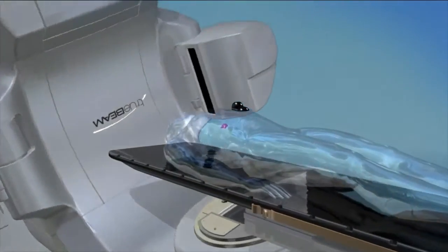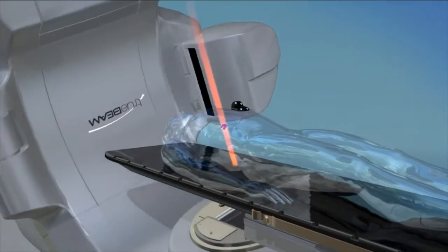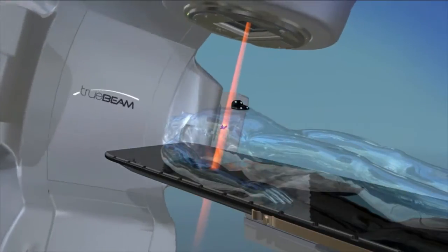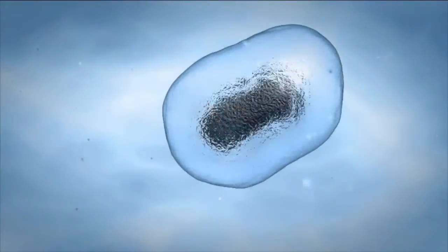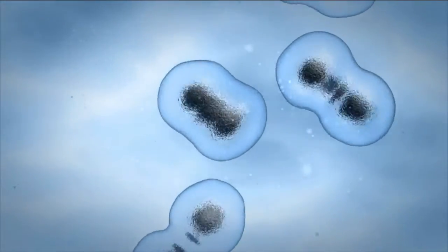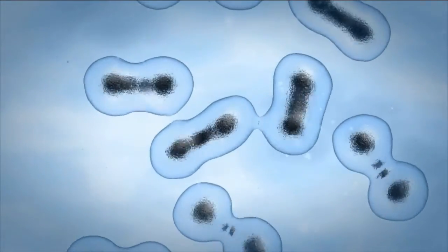These non-invasive procedures work by beaming precisely focused and targeted x-rays into the tumor and destroying its ability to grow. Left untreated, abnormal cancer cells can reproduce at a much higher rate than healthy cells and possibly grow and spread throughout the body.